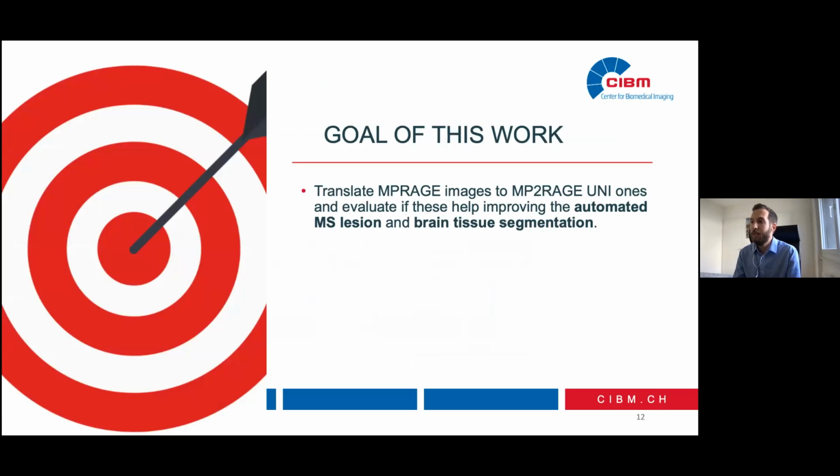And we evaluate this mapping analyzing the performance of two automated segmentation tools, one which segments MS lesions and the other one, unsupervised, which segments brain tissues.